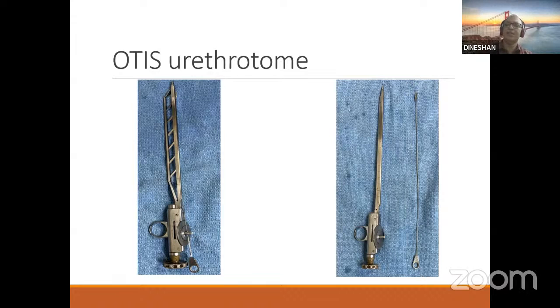So a filiform dilator is passed through the stricture, and this can be connected to this Otis urethrotome, and you can negotiate the stricture using the filiform dilator connected to this. That is the use of this knob. Some of the newer variants of this Otis urethrotome have a hole at the tip through which you can pass a guide wire also, so it can be negotiated using a guide wire. That is about the Otis urethrotome.